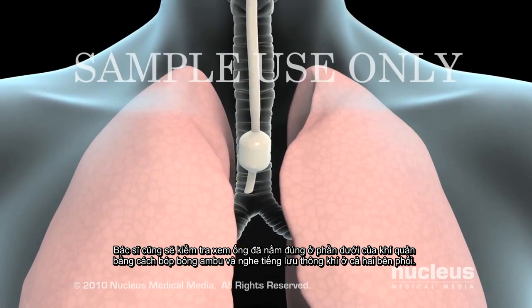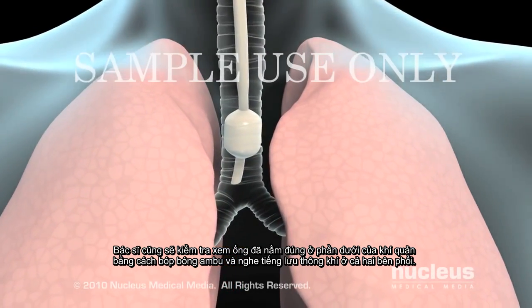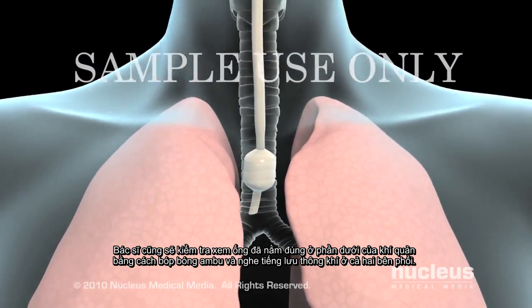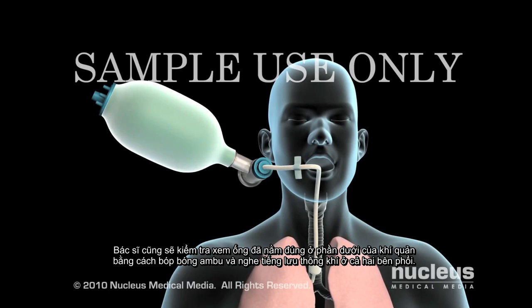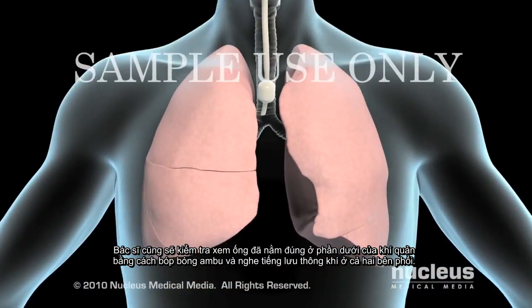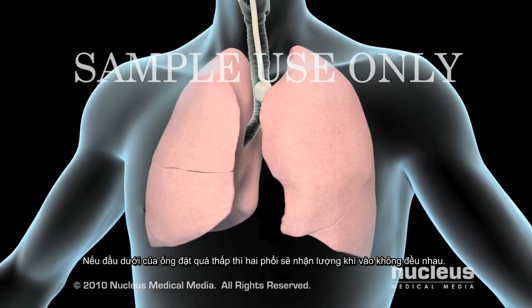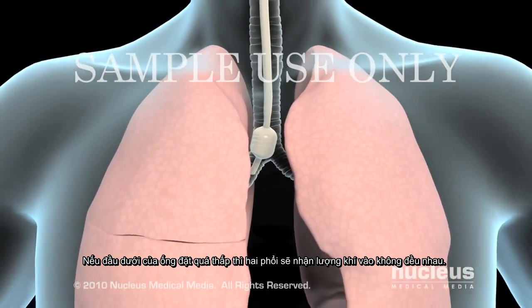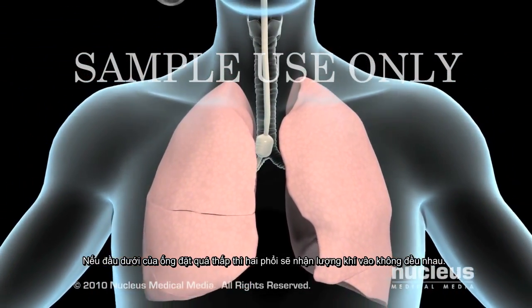Your doctor will check to see that the tube is properly positioned in the lower part of the trachea by inflating your lungs with a special bag and listening for breath sounds on both sides of your chest. If the end of the tube is too low, both lungs will not receive the same amount of air.